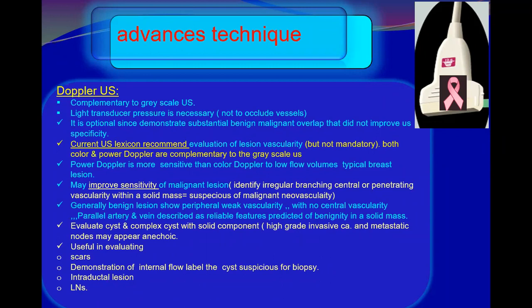Regarding the differentiation between benign and malignant, as we mentioned, there is overlap, but in general, the malignant lesions demonstrate more vascularity with penetrating vessels.